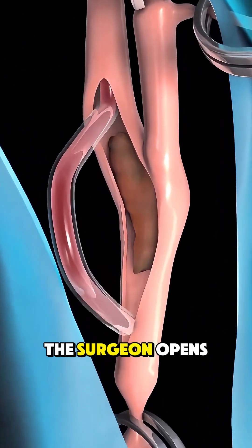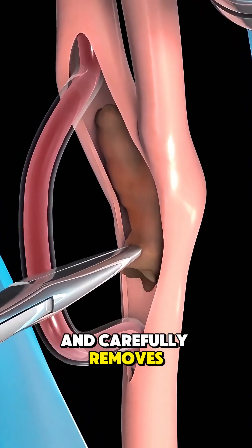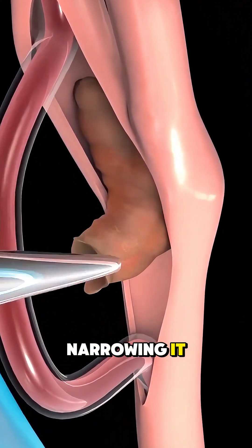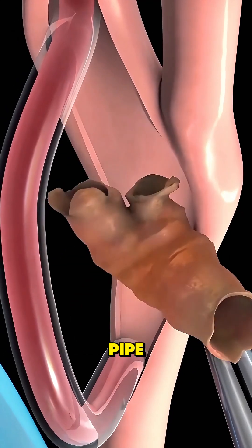Next, the surgeon opens the artery and carefully removes the plaque that's narrowing it, kind of like clearing a clogged pipe.